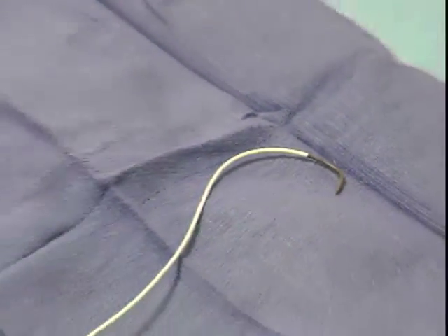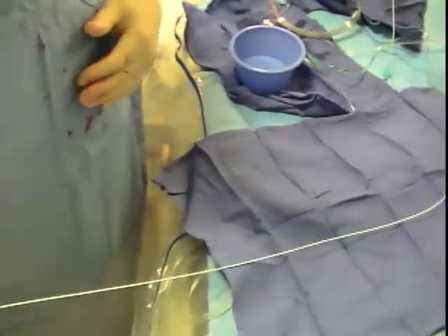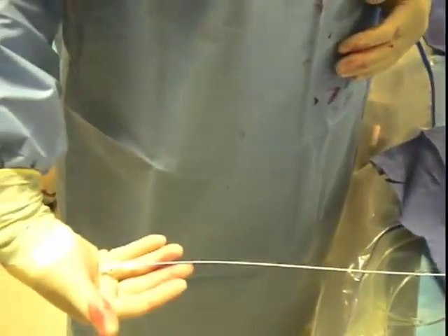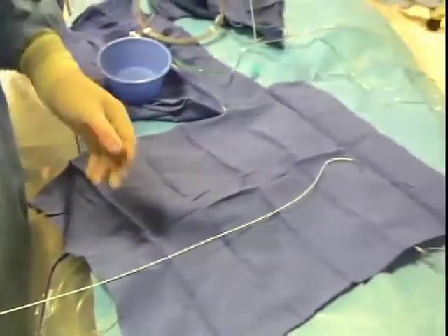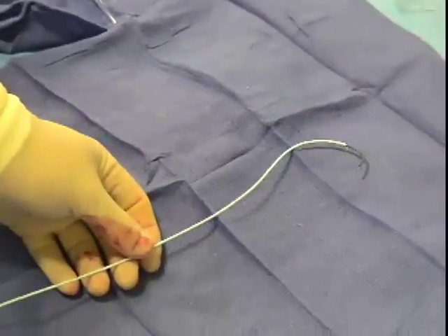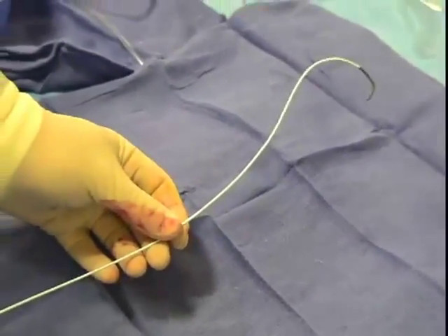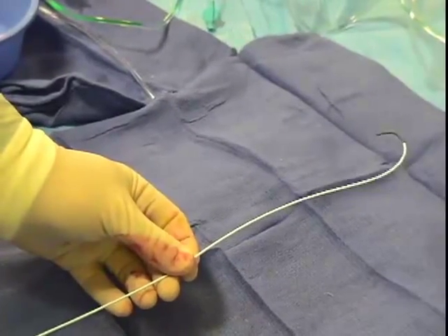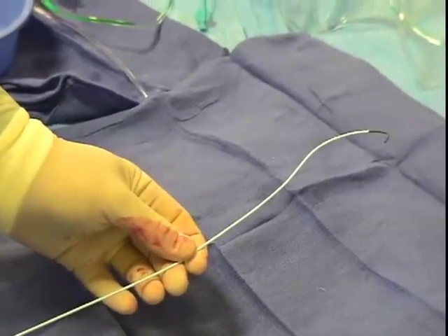This is a COBRA catheter, another type of catheter used for spinal arteriography. Here we see it from end to end, and it also can be used to perform injections into the individual spinal arteries to evaluate the spinal cord.